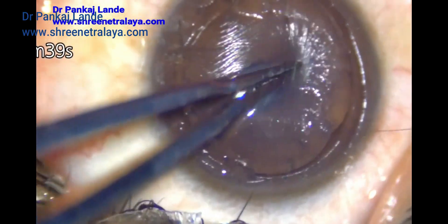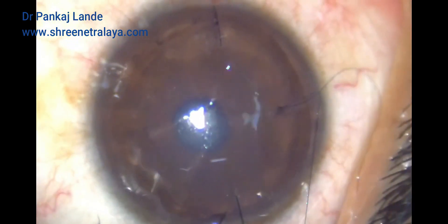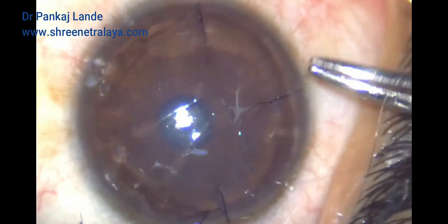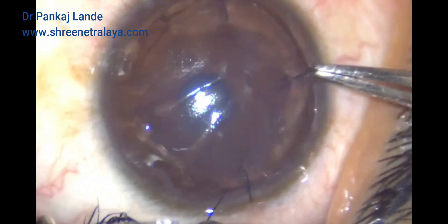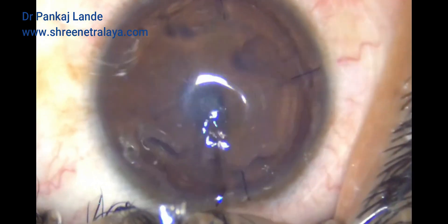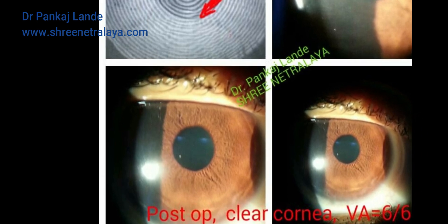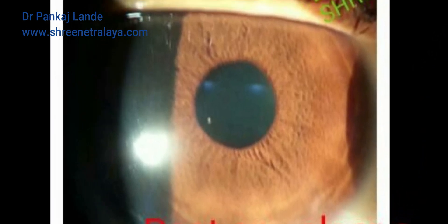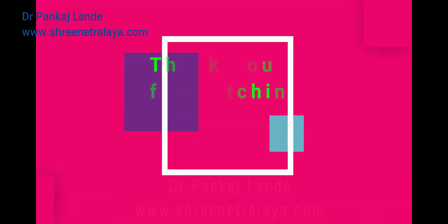You can note I am making the tie of these sutures very carefully — only two knots — and the knot has to be buried on the opposite side where the flap is not present. While removing these sutures, you should not have the knot coming out of your flap as that can lift the flap. You can see the post-operative results of the second case where the cornea appears crystal clear and the patient has no issues with vision or glare. I found two instruments very useful: the Placido disc topographer and the auto-ref machine on retro-illumination mode, which are very useful to diagnose and manage these flap complications comfortably. Thank you, good day.